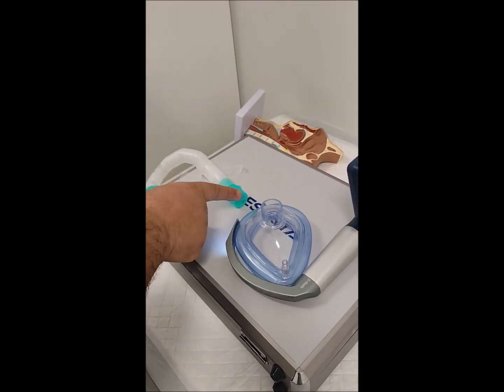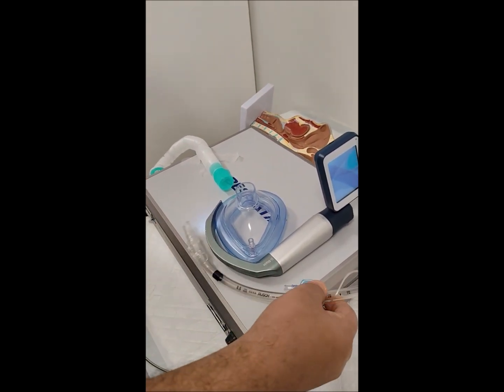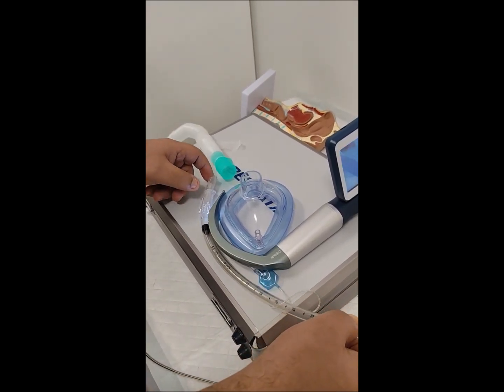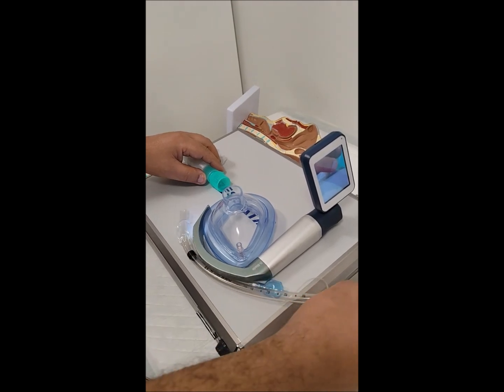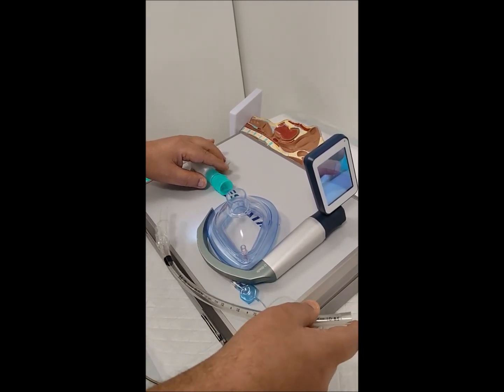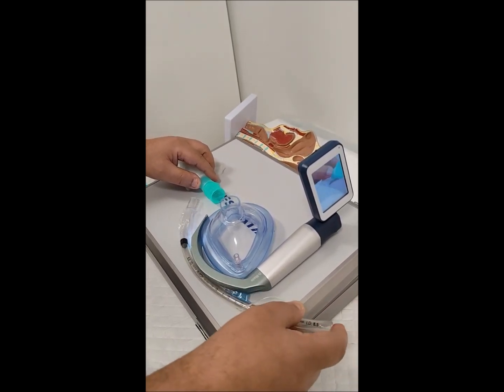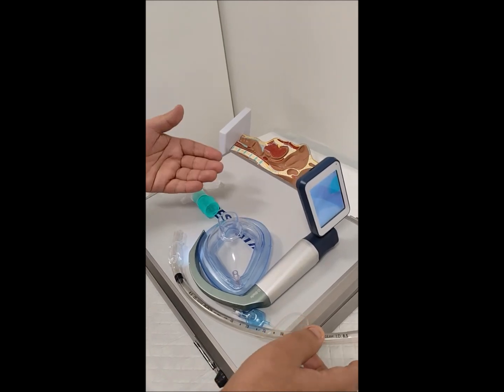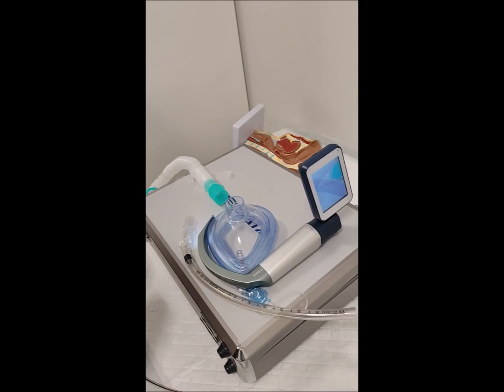The camera here is looking entirely at the larynx, however when you curve the tube it does not take the same curve and usually you cannot insert the tube towards the larynx, especially in the case of a high larynx. Whatever you push the tube, this is the maximum space you have, and usually the tube goes outside the larynx. So in this case of high larynx, we need some instrument to help us perform this intubation.